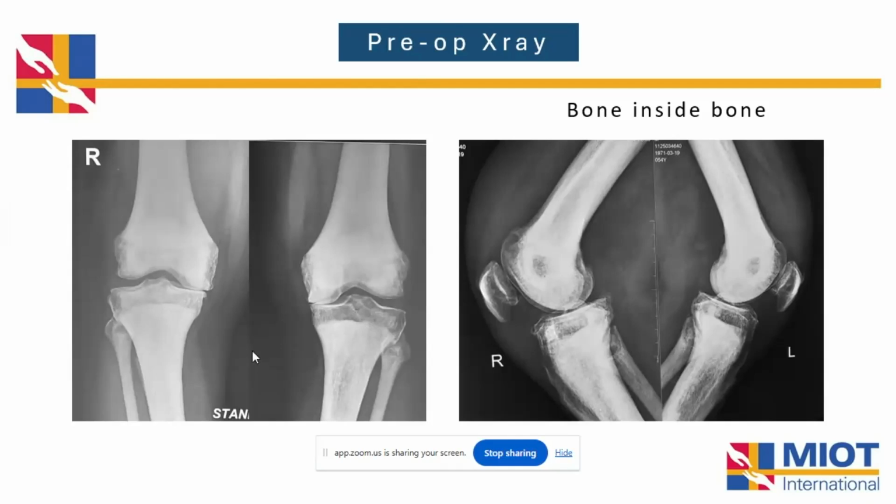Intramedullary drilling may be very difficult. I will do a kinematic alignment without drilling, on both sides, tibia and femur, extramedullary, and based upon the surface markings and morphology, we will cut and accept whatever the varus is without any release. So you will do it with patient-specific instrumentation? On the regular instruments, it will do wonders.